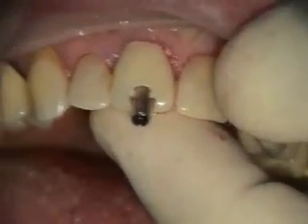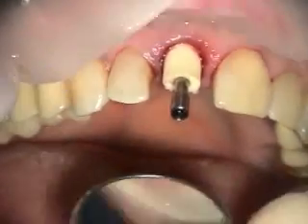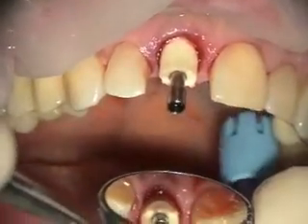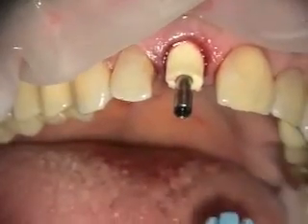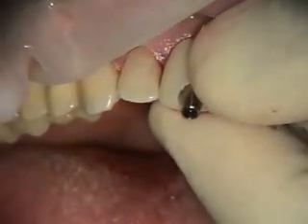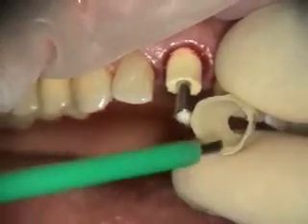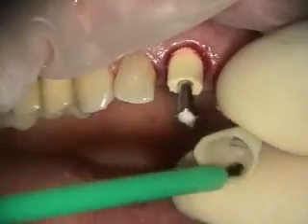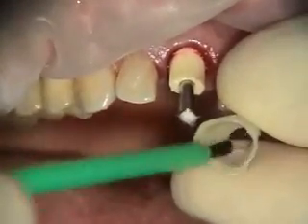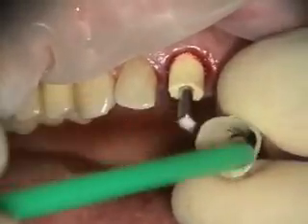I've got my polycarbonate shell adjusted, and I do adjust the positional abutment a little bit on the buccal and the palatal. We need to put the two together. We're using some monomer inside this polycarbonate because that's how we get it to bond.